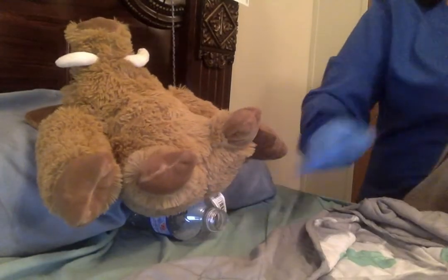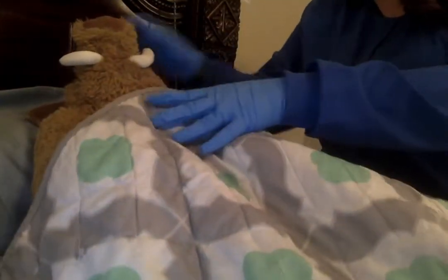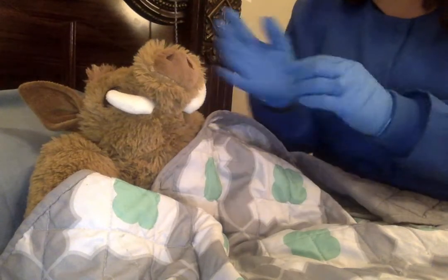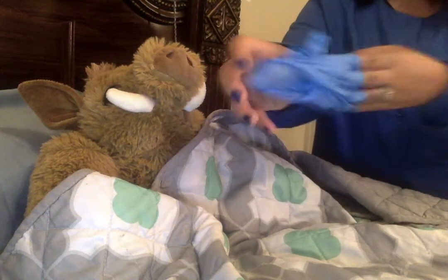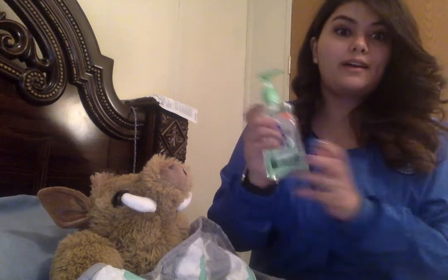And then we're going to help the patient into a comfortable position. You look mighty comfortable. Okay, we're going to take our gloves off. And we are going to, you guessed it, perform hand hygiene again. Yay! Lots of hand hygiene. You don't want to infect people.